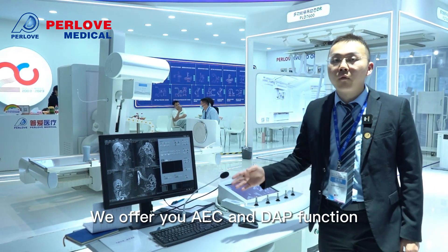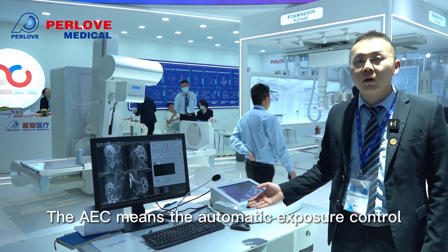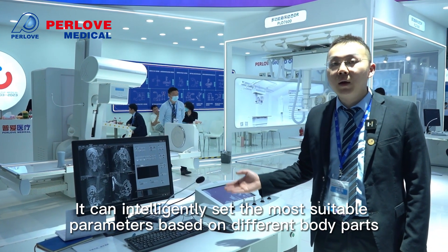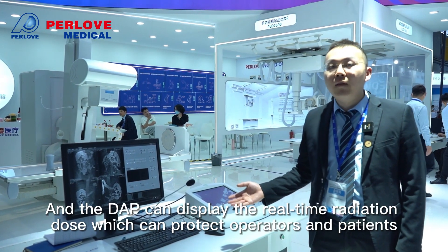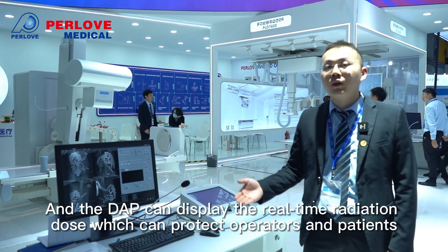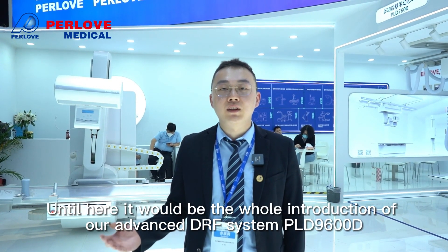Regarding optional functions, we offer AEC and DAP. The AEC, or automatic exposure control, can intelligently set the most suitable parameters based on different body parts, which is very helpful for inexperienced doctors. The DAP can display real-time radiation dose, which helps protect both operators and patients. This concludes the full introduction of our advanced DRF system, PLD9600D.